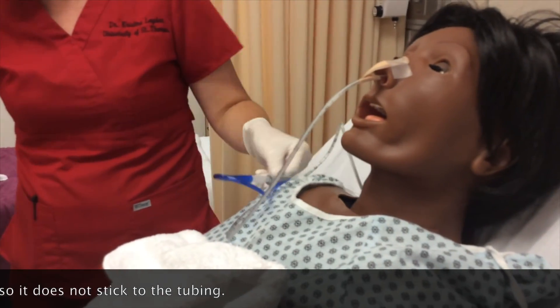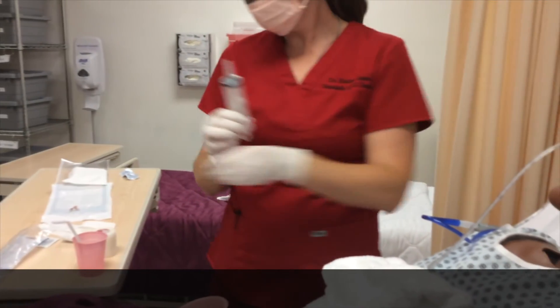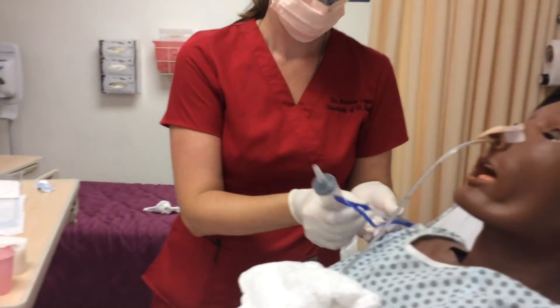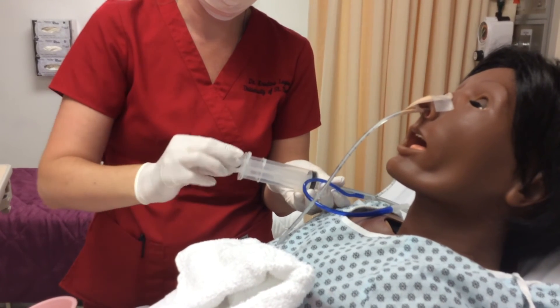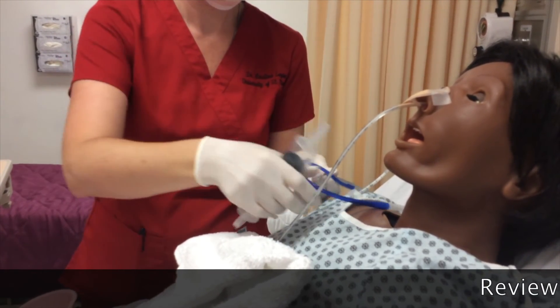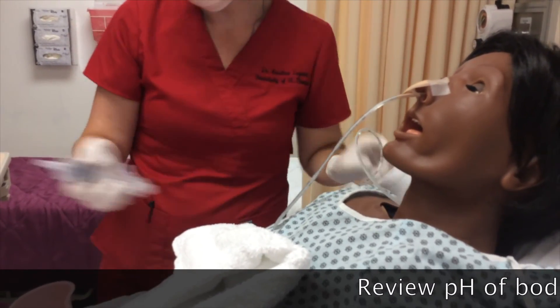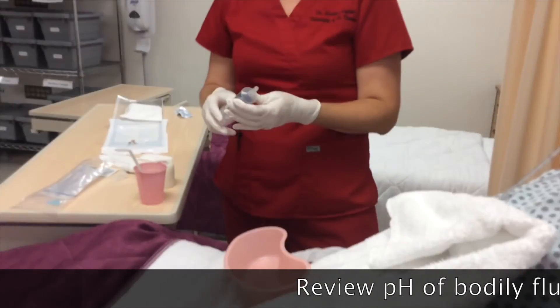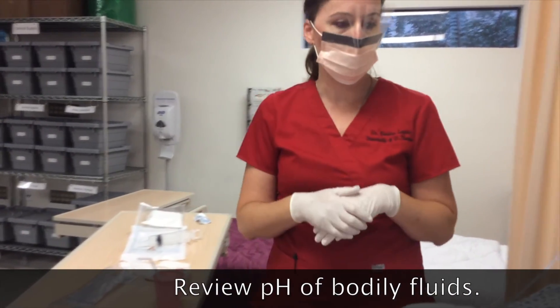At this point, I'll use the catheter-tipped syringe and I will withdraw gastric contents. I can test the gastric contents on my pH strip, noting that gastric contents should be less than 5.5.